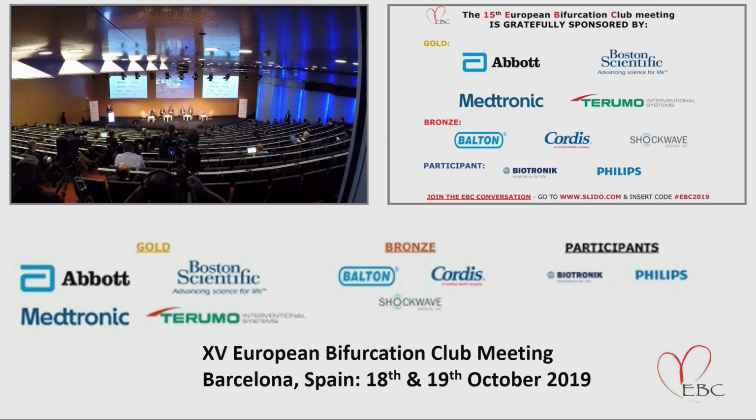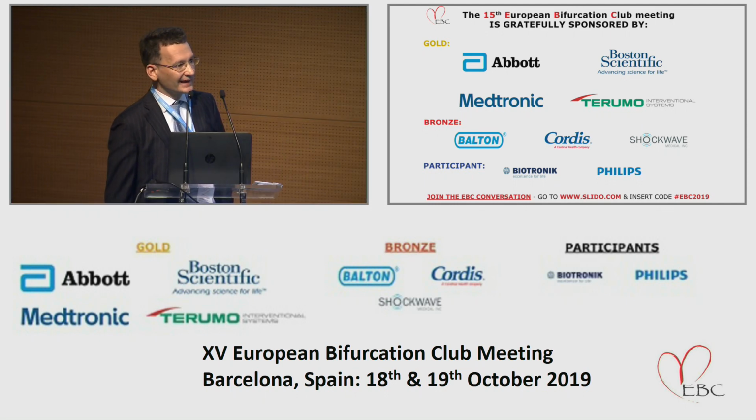Obviously, there will be some cases where you have to put a second stent as a bailout if there is TIMI zero flow or there is a significant extent of disease in the side branch, but that will be limited patients. Of course, as in BBC1 and other cases entailing the treatment of complicated lesions, one stent provisional plus DEB in the side branch could be, on the whole, a provisional strategy, and of course, in order to ensure long-term patency, we could end up implanting a second stent in the side branch. But I think this will work the same way you described.